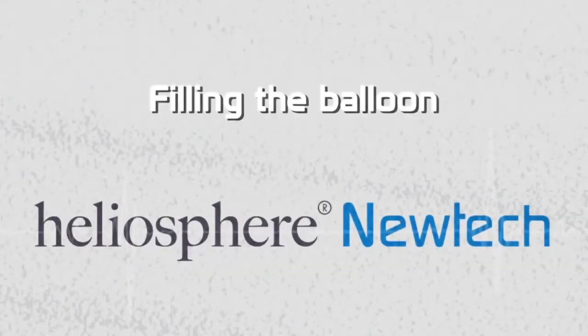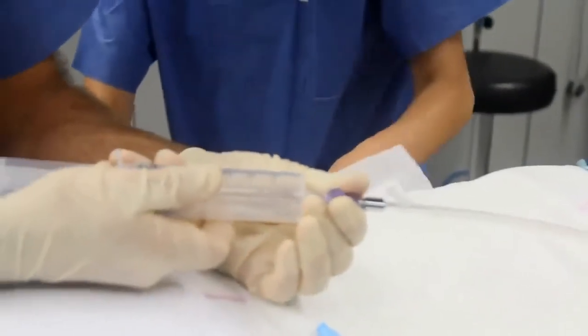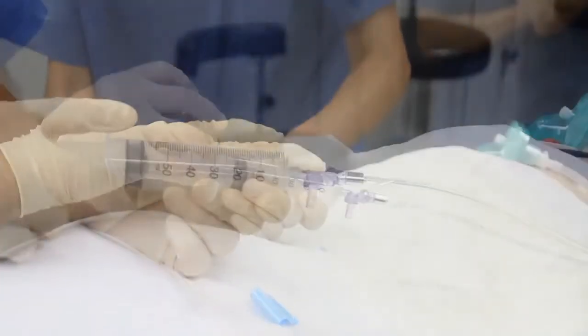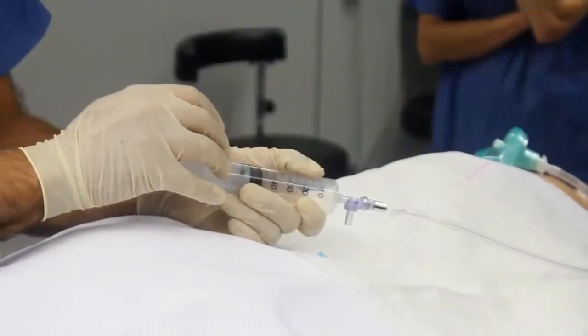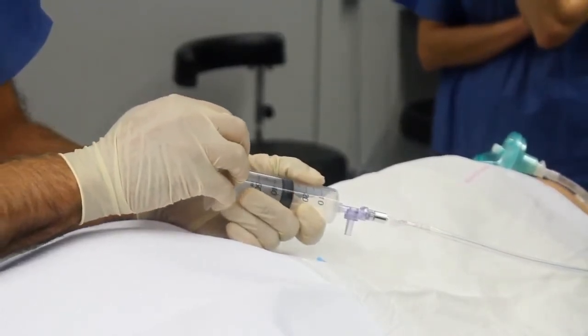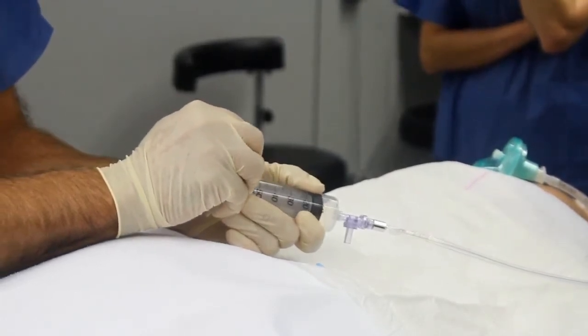Filling the balloon. To fill the balloon, first screw the 60 cubic centimeter syringe into the anti-return valve of the insertion catheter. Then, slowly inject air using the 60 cubic centimeter syringe to inflate the balloon. One air injection should be done slowly and last a minimum of 10 seconds.